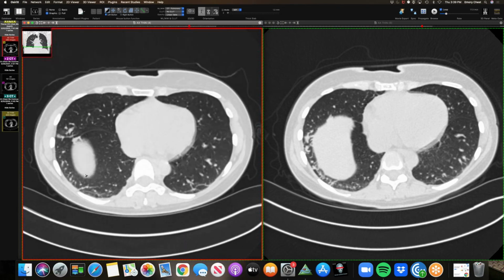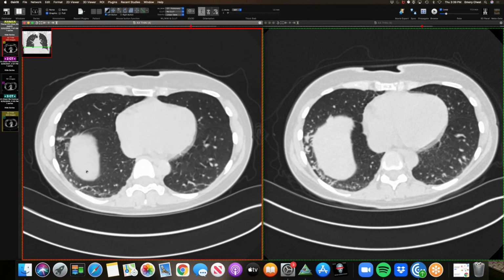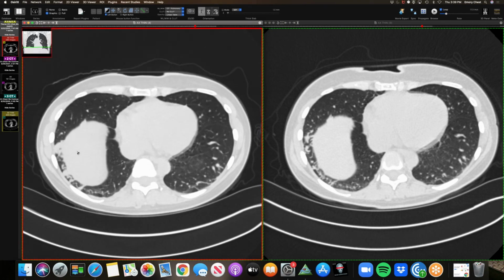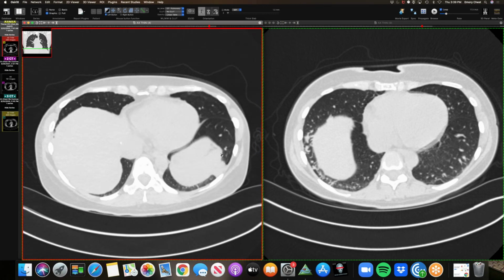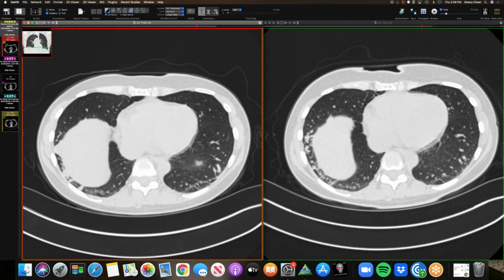Yeah, that's quite a nice example. I don't think I've ever seen dilation to that degree. I mean, that's really extraordinary. Most of the time, what you see is ordinary looking vessels that go all the way out to touch the pleural surface. They don't get that far, but this is the first time I've actually seen actual dilation beyond what you saw centrally. This was the most impressive one I've seen. Yeah, same.